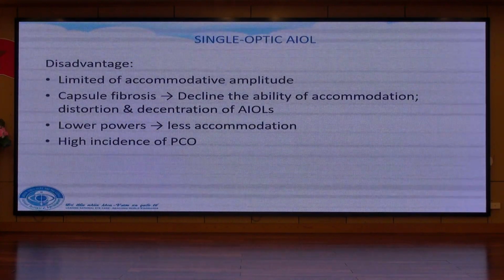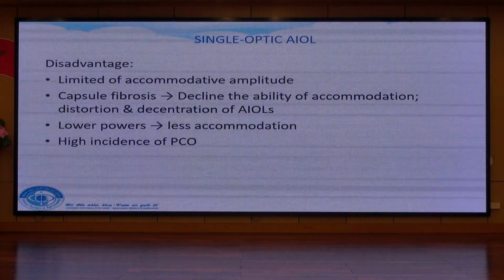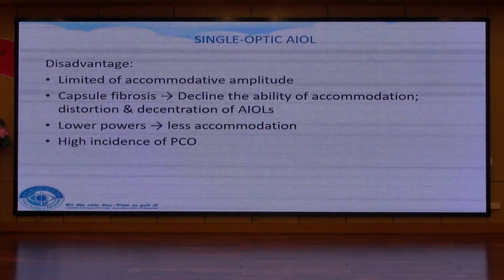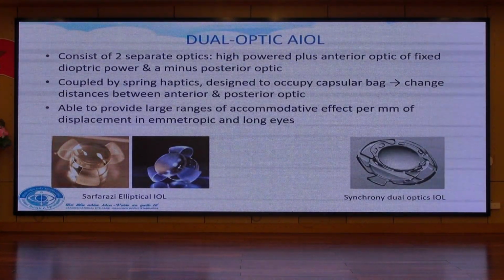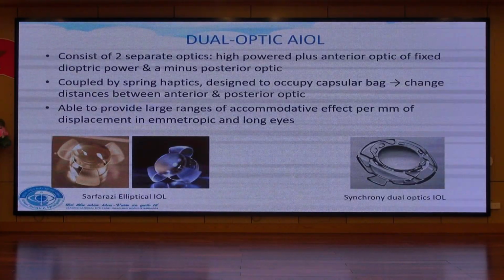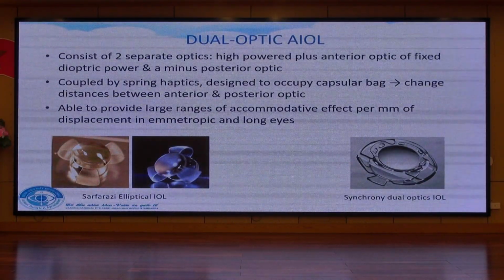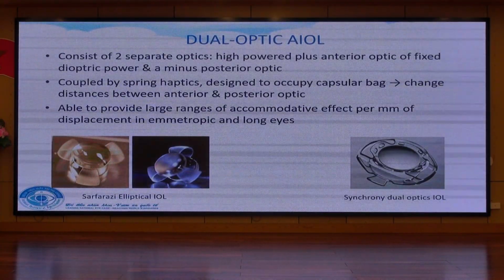And the low powers provide less accommodation, and there is a higher incidence of posterior capsular opacification. To improve the outcome of single optic IOLs, there is a dual optic IOL.